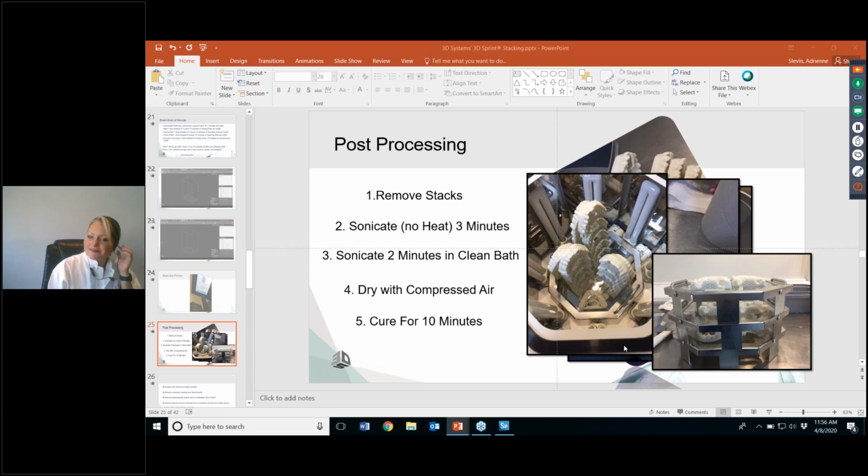Thank you so much, Adrian. I just have one question. How about stacking crown and bridge full arches? Yes, so I wouldn't stack anything with a removable die yet. We're working on those. It's coming. This one was specifically geared toward cases that don't have removable dies, so they're geared toward orthodontic arches, since there are so many arches that go into a series right now.